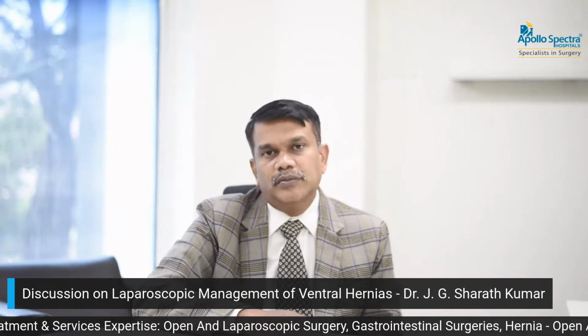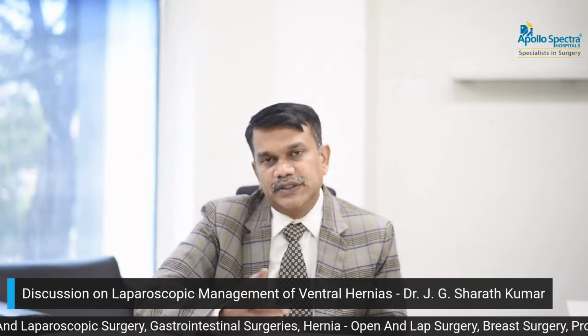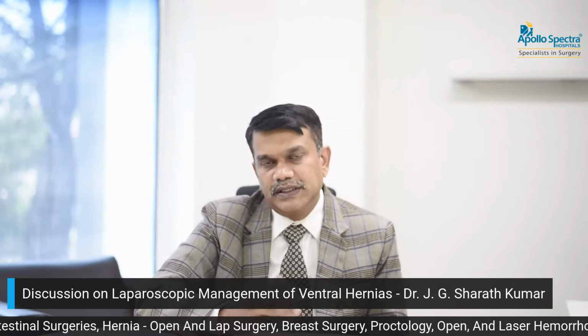So, doctor, what are the advantages of laparoscopic ventral hernia repair? Because there will be less tissue trauma, incisions are less, so scars are less, cosmetically better, less dissection when it's a simple hernia. When there's an incision, complications will be there. So less pain, early recovery, so shorter hospital stay. These are the things.